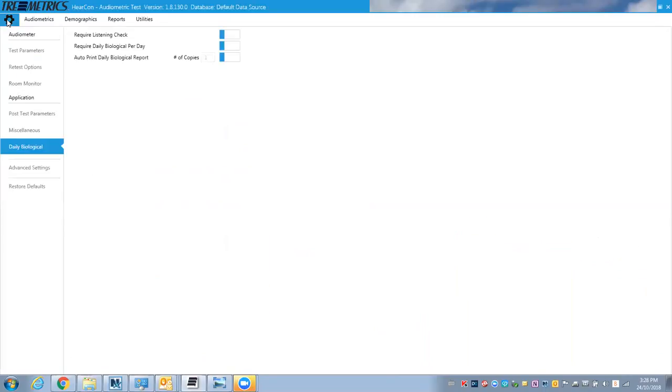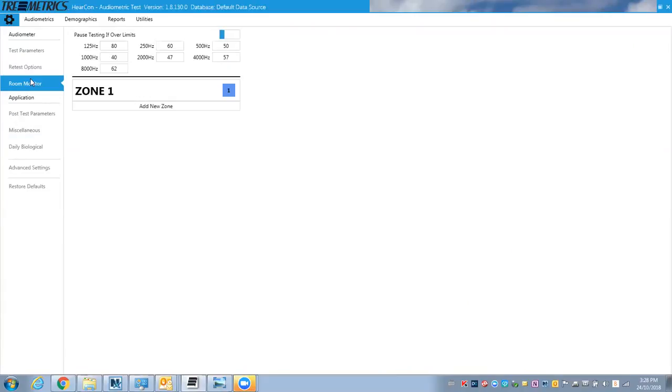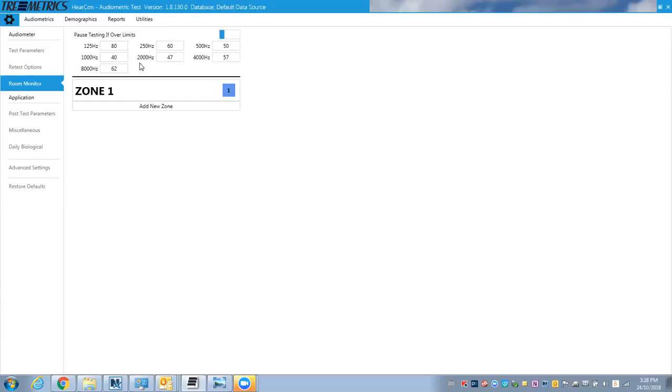So let's go, actually I'll show you where that is. If I go to the room monitor, you can set those different values. If I turn this on, then during a test it would pause the test, but because we're just giving an overview, I'll turn it off for now. But you could set those to whatever parameters you want to use. So if it goes above these limits, it pauses the test.